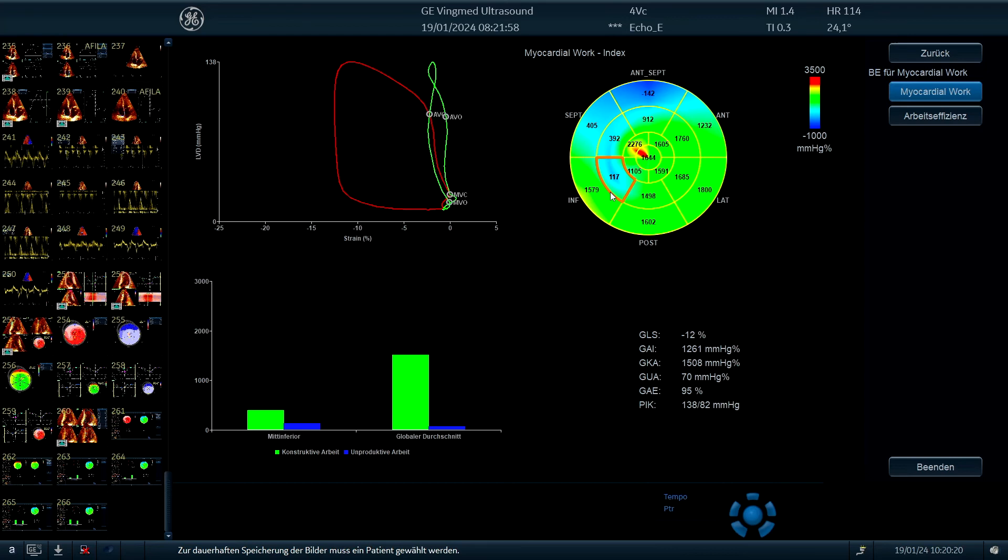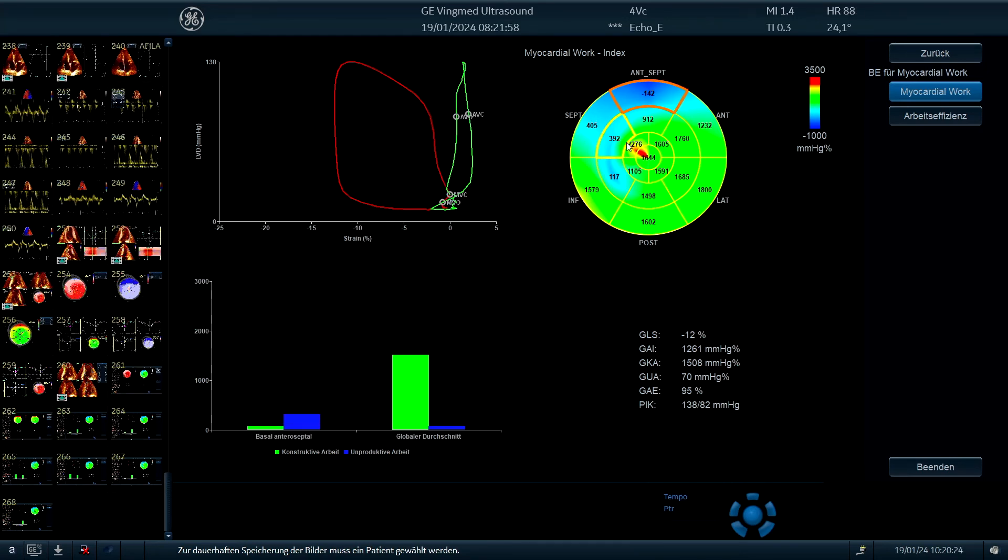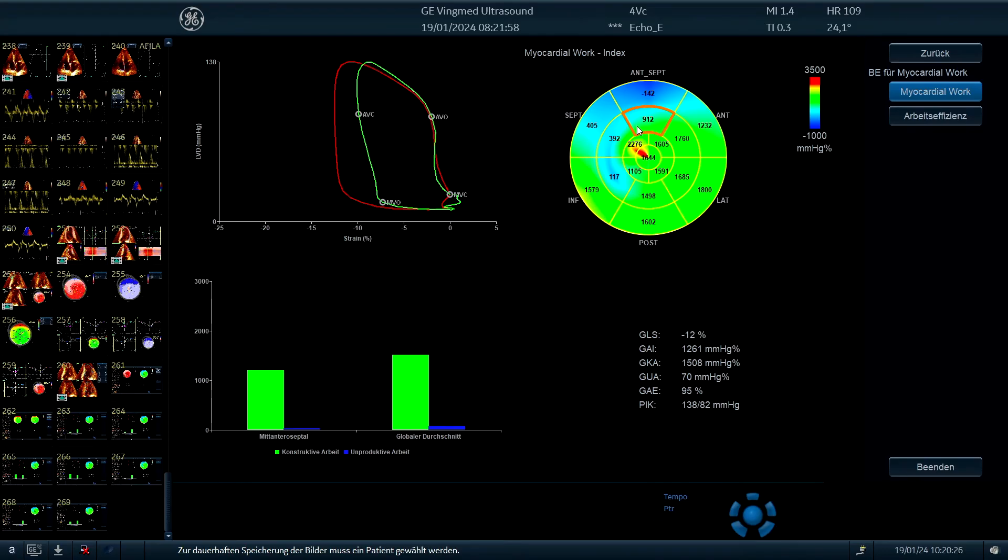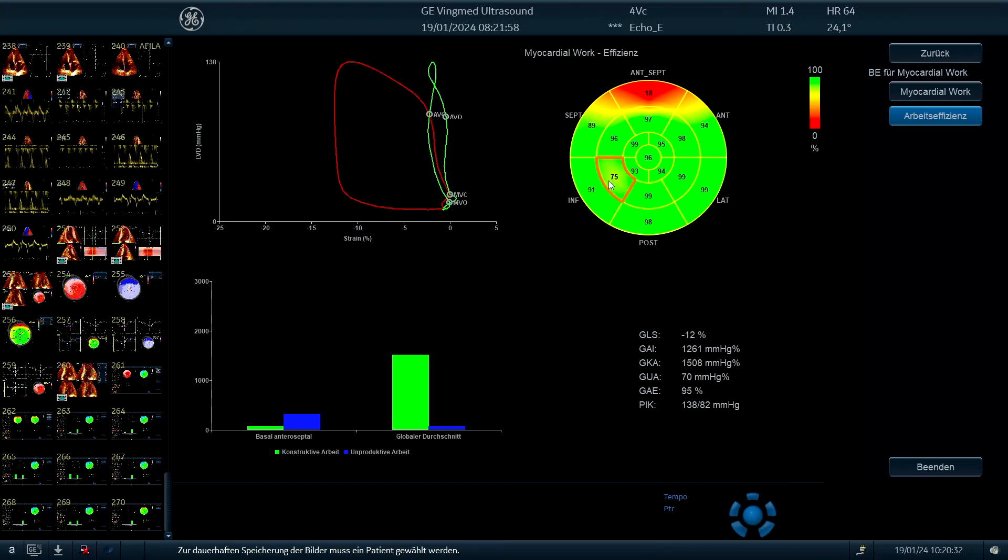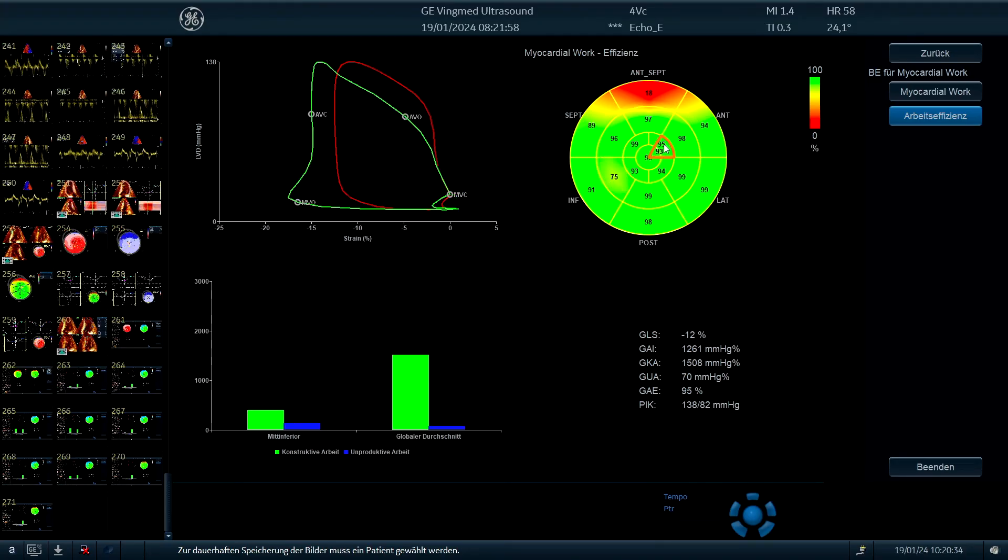And the ones who are not working properly, you see the different curves. So this is less when the segments are working less. And here we have the work efficiency, and most of his segments are working quite efficiently, which is quite good.